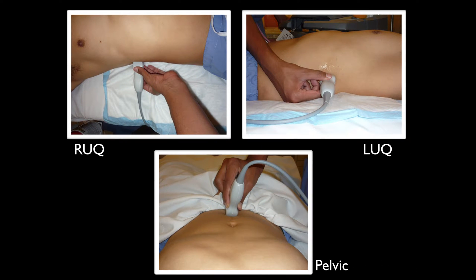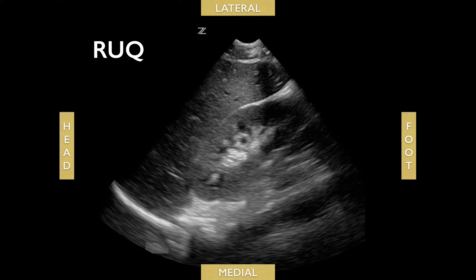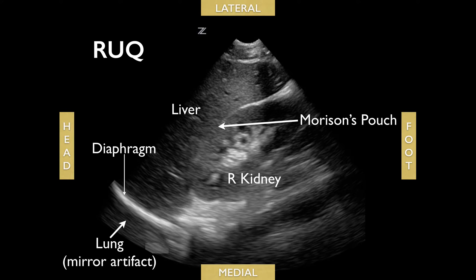Here are the different abdominal views. For the right upper quadrant, place your probe in the mid-axillary line at the tenth rib space with the indicator up towards the patient's head. From superior to inferior you'll see the lung, diaphragm, liver, Morrison's pouch, and then the right kidney.